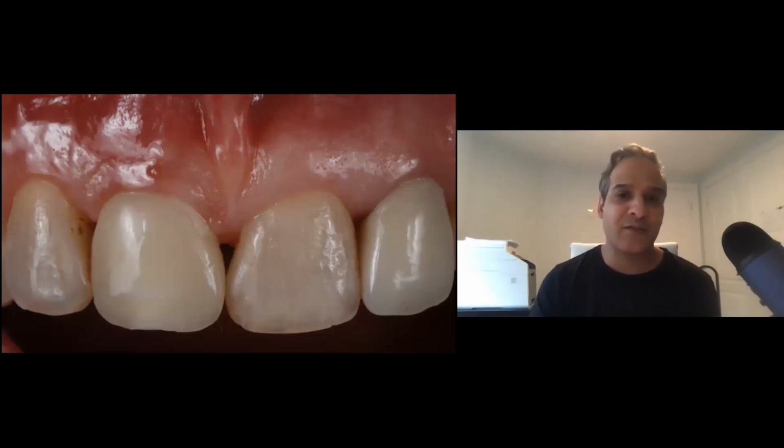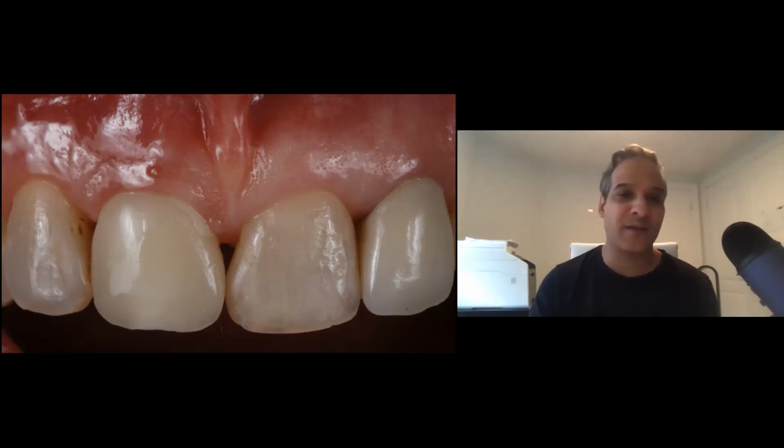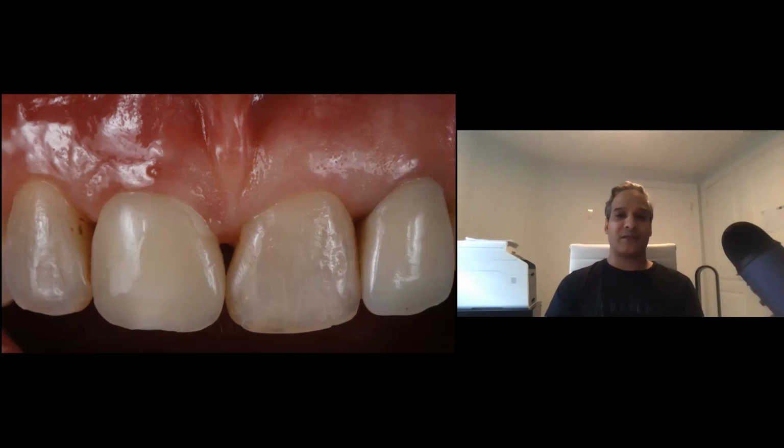Now this poor lady, this was done right before our break with the virus. So I'm hoping her temporary is still in place, but now she's at the point where she's ready to go see the dentist. Actually, she's going to be seeing a prosthodontist, I think, to do the final crown on this. So you can see the key point here is look at how the tooth emerges from the tissues. The papillas and everything look nice. It's got symmetry with the 2-1. And once you get a nice, realistic looking crown there, it's going to look much, much nicer than what she ended up with.